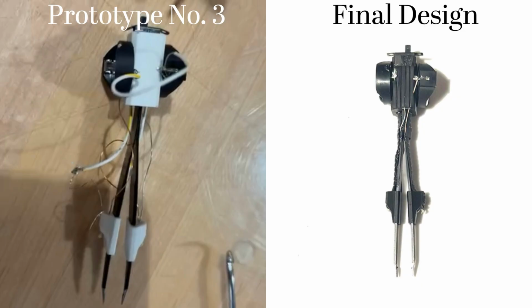Our next prototype incorporated smaller LEDs, smaller batteries to create a less bulky casing, and shorter forceps to meet our client's request for 3-inch forceps. It still had exposed wiring, though, which made the design look less clean and could possibly be hazardous. For our final design, we added rubber to the prongs to cover the wiring and assist with grip.